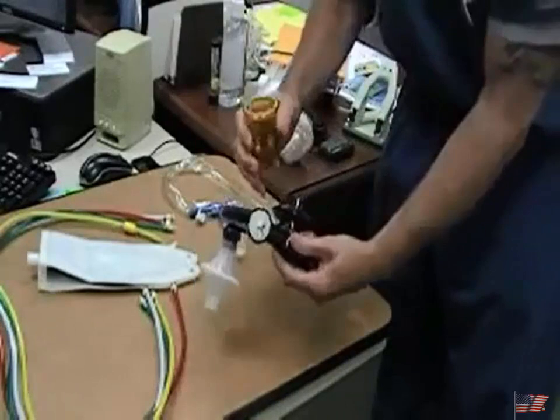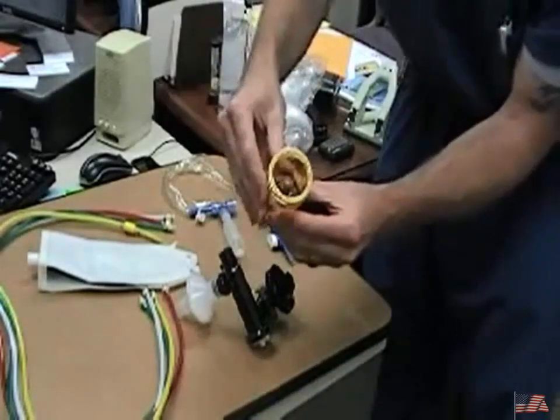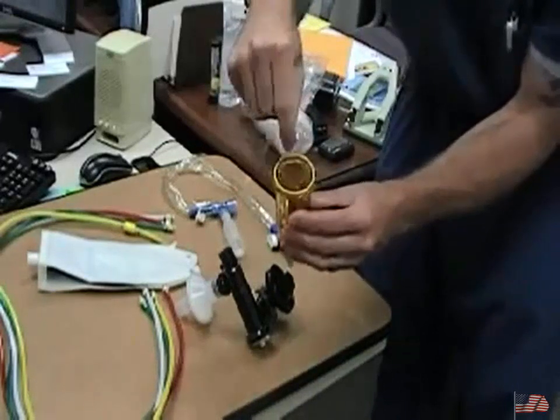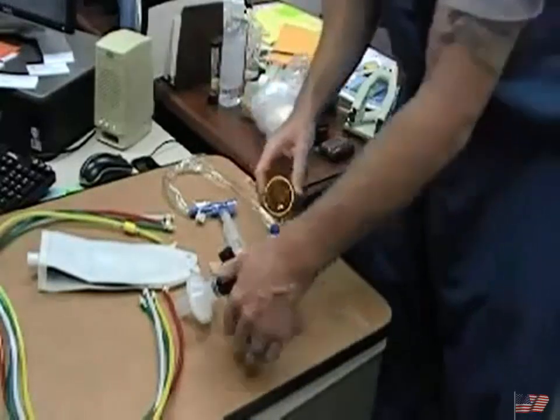Remember with your nebulizer, okay, that there's a little diffuser piece in there. I don't know if we can see that. Sometimes that's loose or missing. If it's loose or missing, it won't nebulize without that piece, so make sure that's in there.